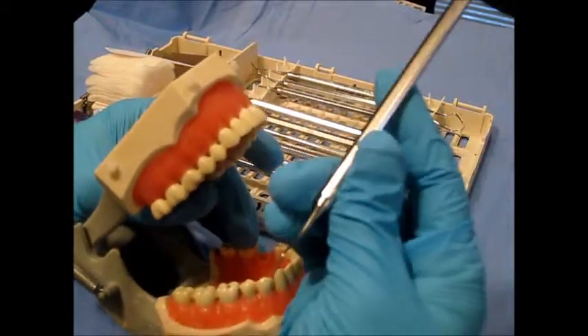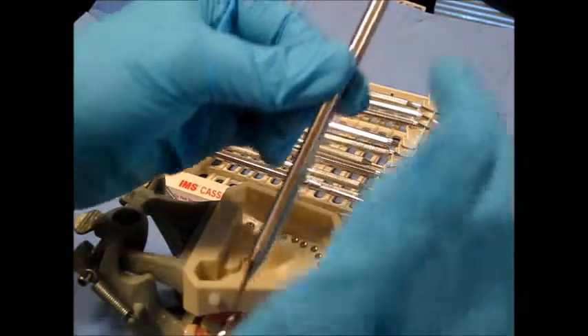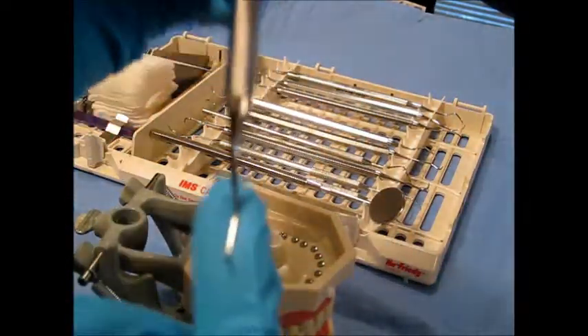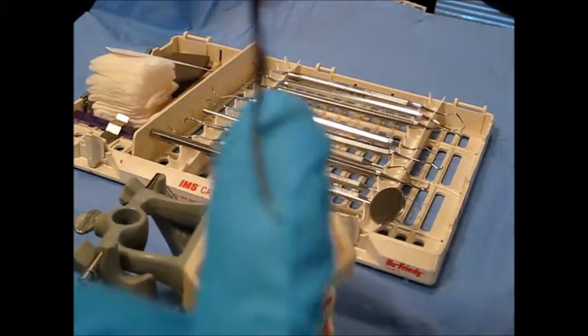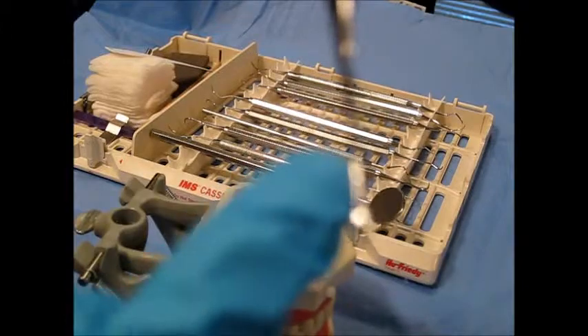It has one usable cutting edge per working end, and we always want to use the lower cutting edge. It's kind of hard to see on the video, but we want the lower cutting edge.